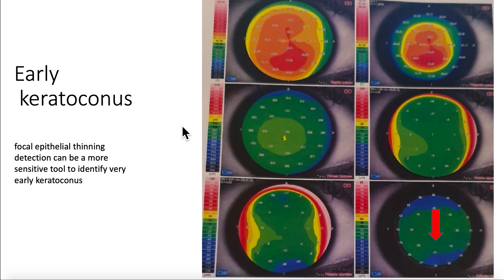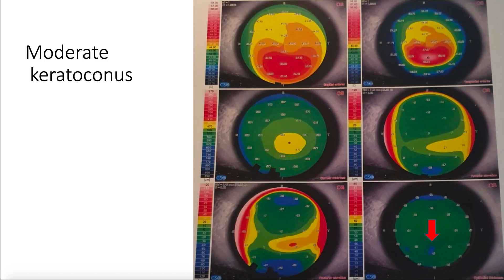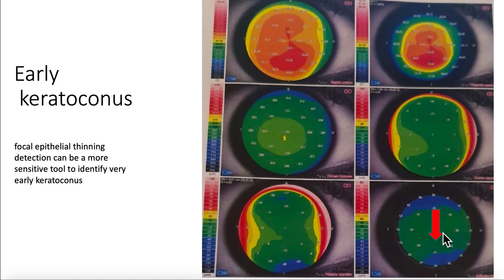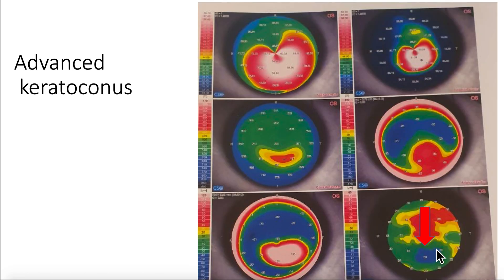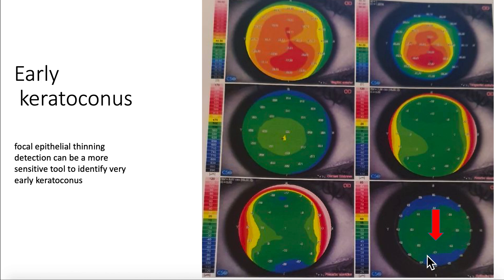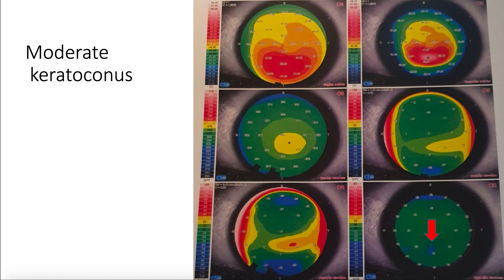In early keratoconus, we see a small focal epithelial thinning. In moderate keratoconus, we have a donut image area and the difference between the thinnest and thickest point is larger than in the early case. In advanced keratoconus, the thinnest point is even thinner, and the epithelial delta between the thinnest and thickest point is higher and higher. By comparing this delta, we can monitor the progression of keratoconus.